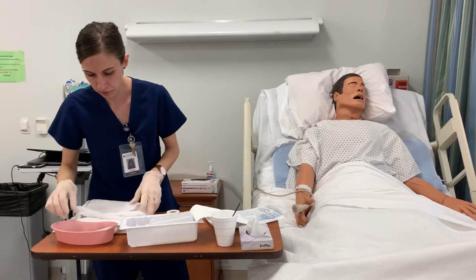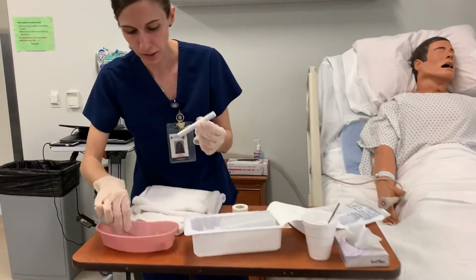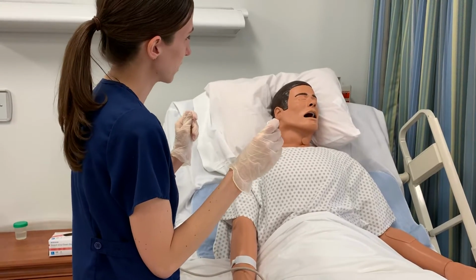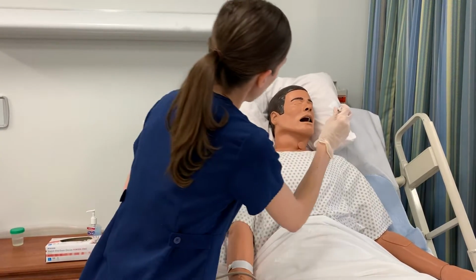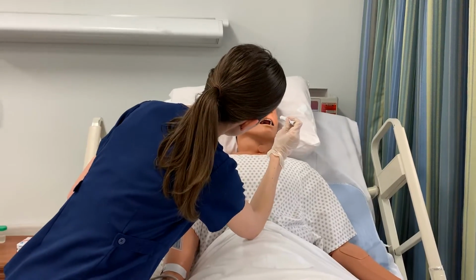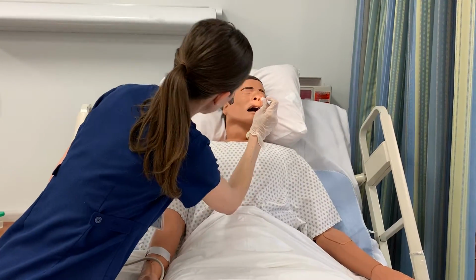And I have some of my supplies here. I have my pen light. I'm going to be looking in the nasal passages. I'm just going to be looking for any signs of obstruction, nasal polyps, septal deviation, or irritation of the mucosa, and I don't see any.